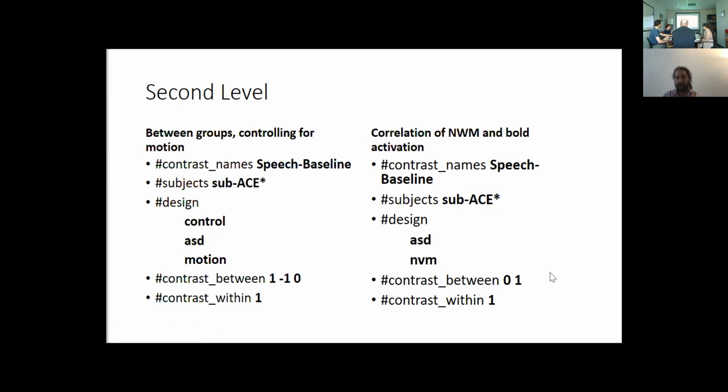That looks perfect. Well, it's going to work either way, I guess. But the NVM variable, does it have zeros or does it have missing values for the control subjects? It has NA. Okay. Either way, it would work, because ASD has zeros for the control subjects. So either one has a missing value, or both of them are zeros. So those subjects are always removed. So yeah, that looks perfectly fine.